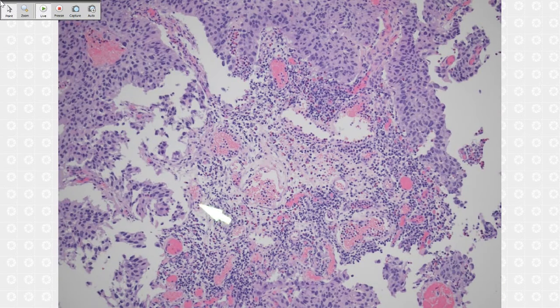I don't think invasion, because it's a very round bottom. We'll think about invasion. First thing, like a pointed end, right? Usually for me it is a single cell, very small gland. Also look for retraction artifact. Usually in urothelial invasion, you have retraction surrounding the tumor nesting. But see this one, if you see a very broad round bottom, it's not invasion. Okay, see this one is still non-invasive.